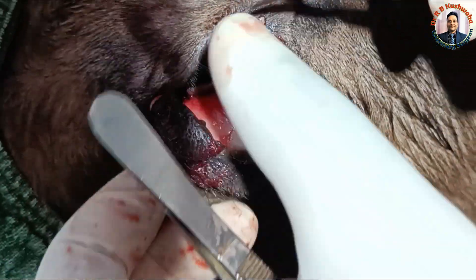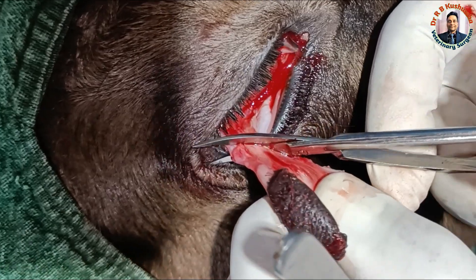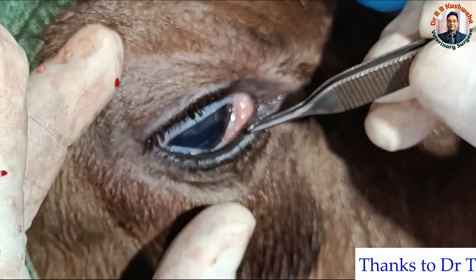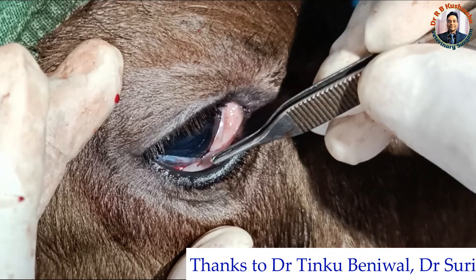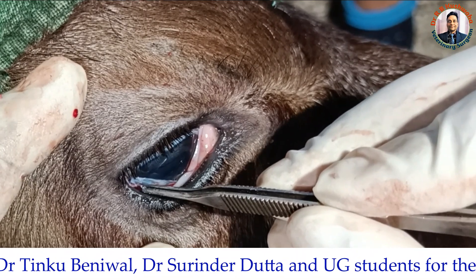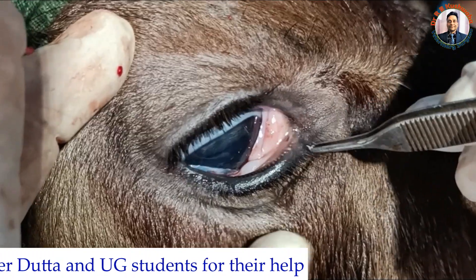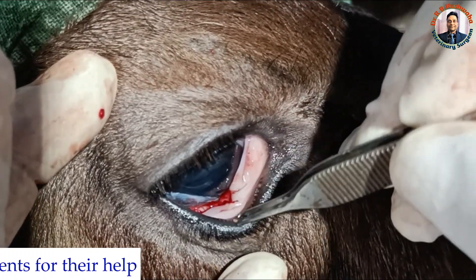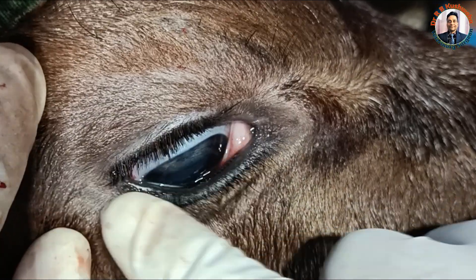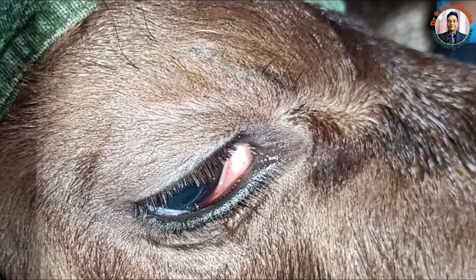We simply remove this mass close to this one. Now you can see I have resected the mass which is attached with the palpebral conjunctiva, and this portion is the portion attached with the cornea. There is no need to suture — whichever portion we have resected will heal automatically.